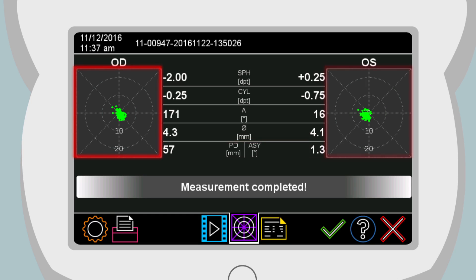The left and right side of the screen show the gaze charts, which indicate the viewing direction of the child. Do not be alarmed if few red dots show on the chart. It simply means the child was not looking directly at Smiley's nose at the instant that particular infrared photograph was taken.